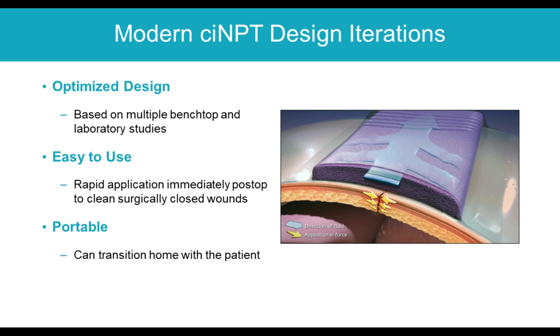So I can operate on a patient, keep them overnight in the hospital, discharge them home the next day, and that obese diabetic patient is still getting negative pressure therapy delivered to their incision for 7 days at home. We don't need to keep them in the hospital like we once did for this incision management.